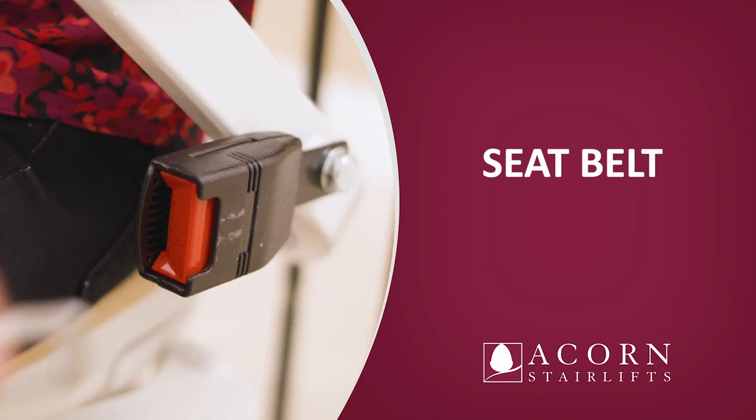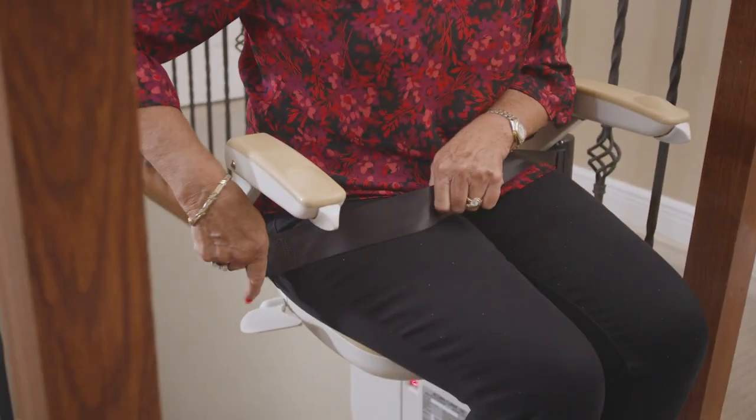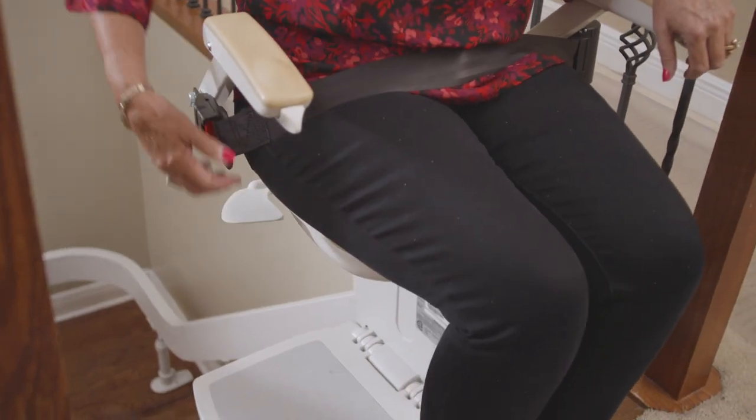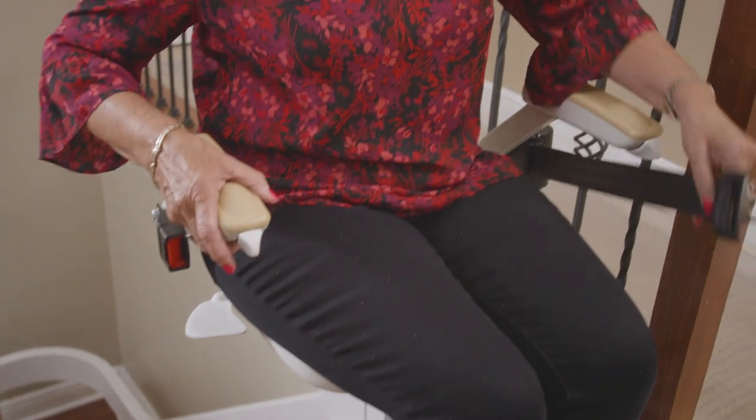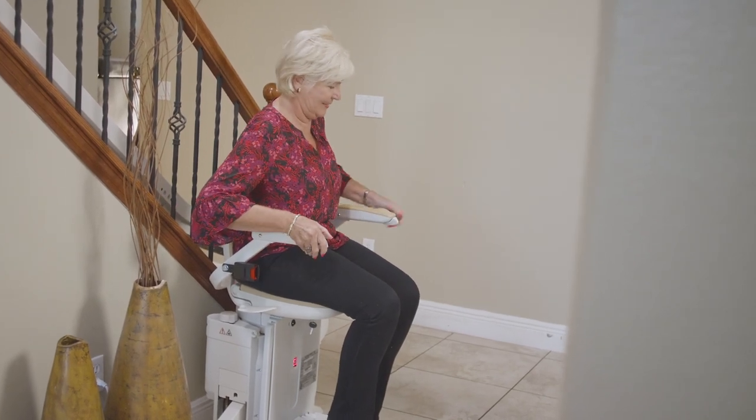Seat belt. To fasten the seat belt, pull out the belt and insert the clasp into the buckle. A positive click should be heard indicating that the lock has engaged properly. To release the seat belt, hold the belt with one hand and press the release button on the buckle. The clasp will automatically release and allow the belt to retract. The seat belt must be worn at all times when using the stairlift.